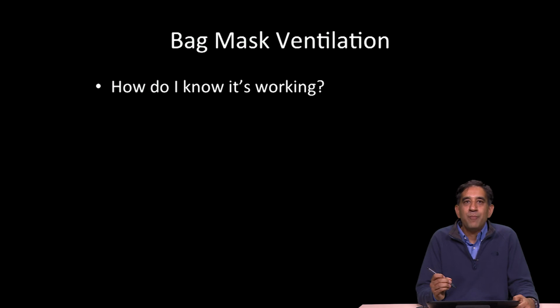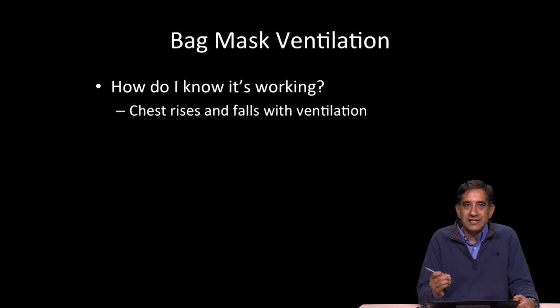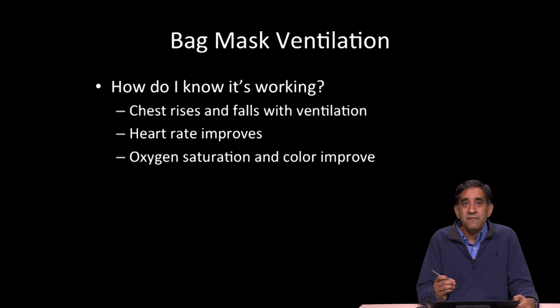How do you know that your bag mask ventilation is working? You want to look for clinical signs that the patient is improving. So you'll see that the chest rises and falls with ventilation, that if the patient has a heart rate, the heart rate tends to improve. And then finally, if you have oxygen saturation monitoring, you'll see the saturation come up, and usually the patient's color should improve as well.